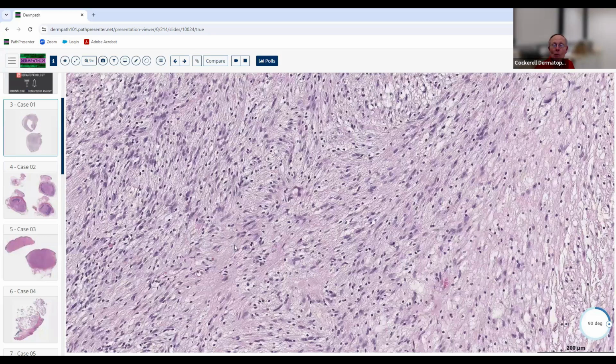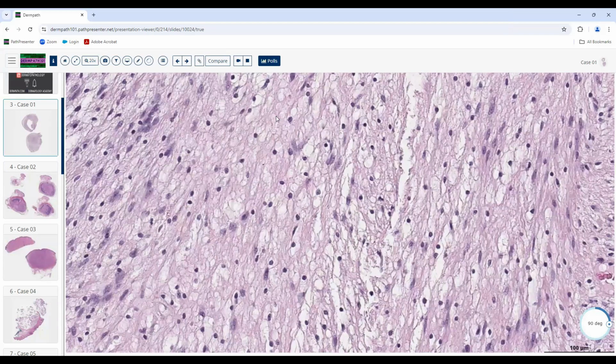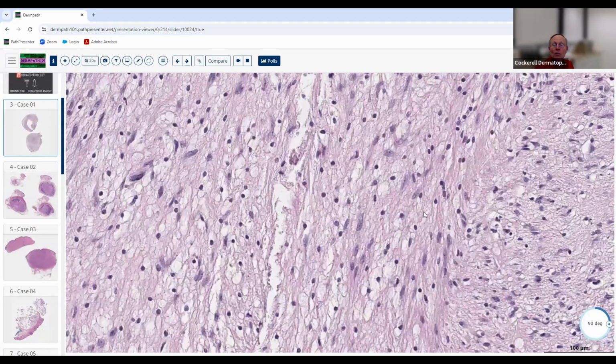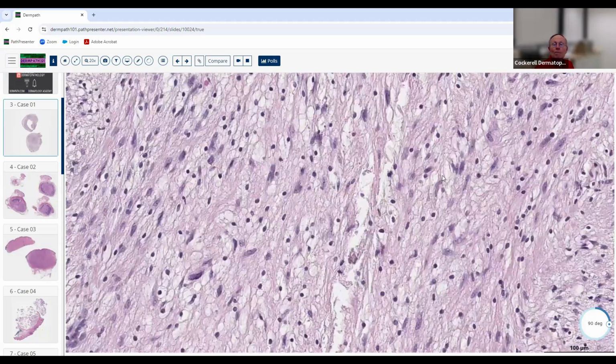They often have a fibromucinous stroma. You see all this mucin in here? Very characteristic of neural neoplasms. Not all of them; a neuroma, for example, won't have much fibromucinous stroma. But a fibromucinous or just mucinous stroma favors neural. And of course, whenever you see mucin in a neoplasm, what other kind of cell will you often see floating in that mucinous stroma?